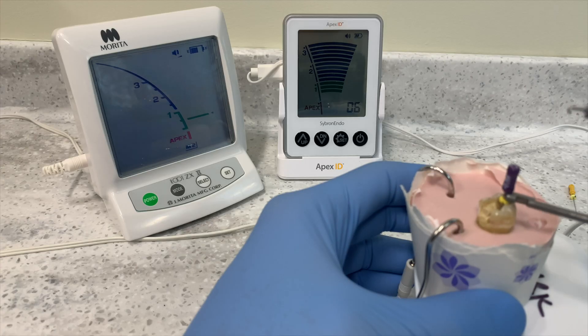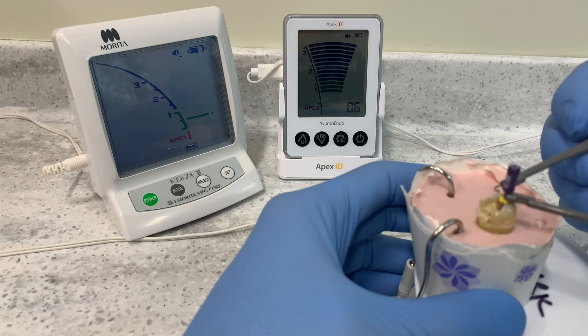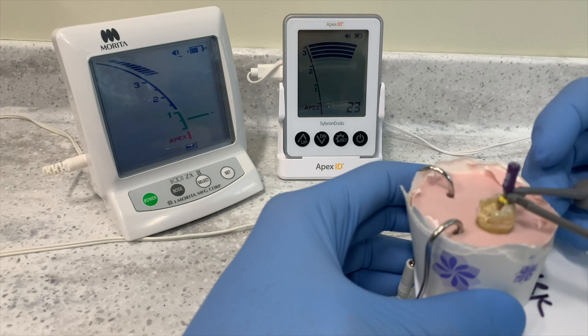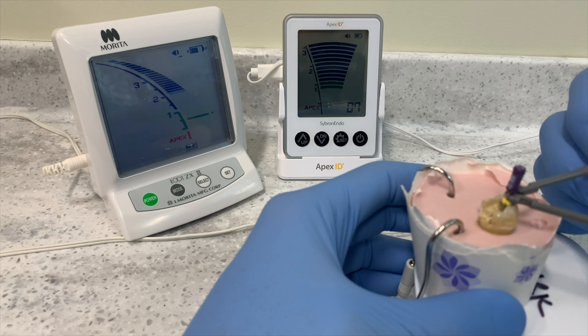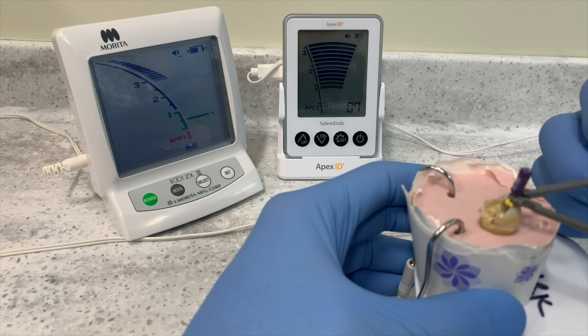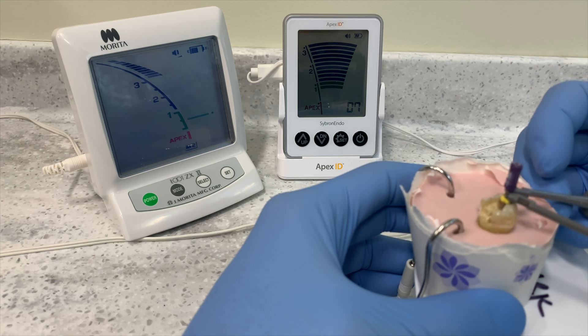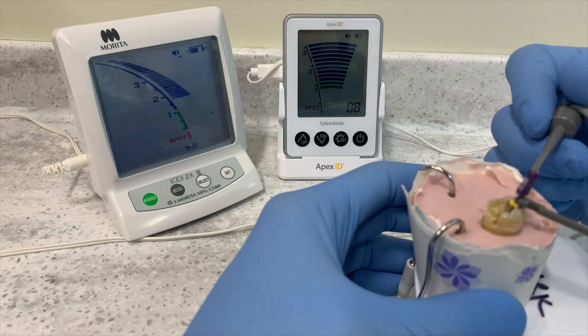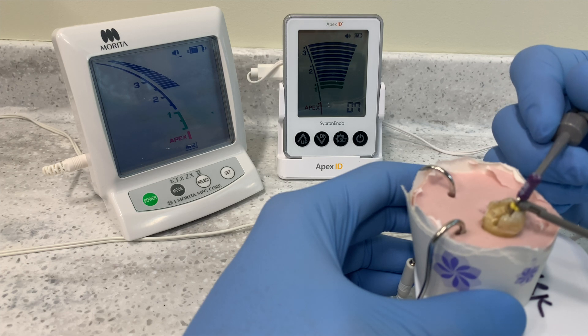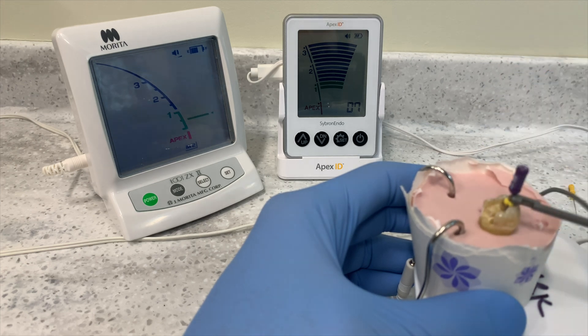And if you really want to get crazy and put two apex locators on at the same time, let's see what happens. They go into like defibrillation. Oh, it's a little crazy here. The Morita is not happy, and I think the Cybron one is winning. They're beeping at the same rate. All right, hopefully that helps. We'll talk to you soon. Cheers.